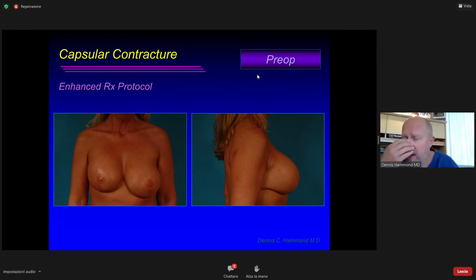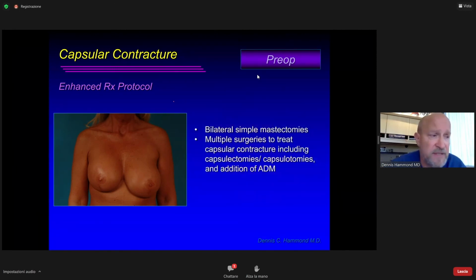I know that with the Polytech people, they've noticed with their polyurethane implants, as of a presentation I just saw this weekend at the Barcelona breast meeting, they've only had 3 cases of it. So that's a very low risk. So I think it's going to be up to each individual person to decide whether or not they want to try to use polyurethane foam-coated implants.